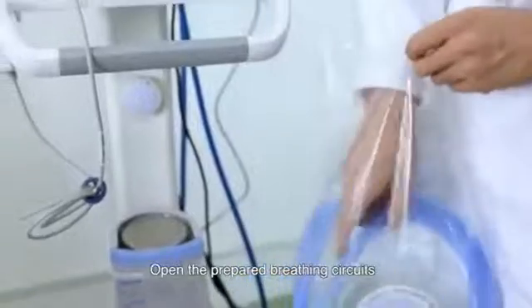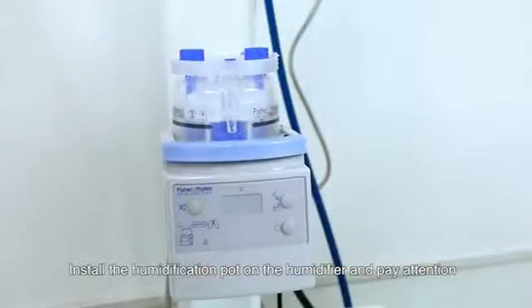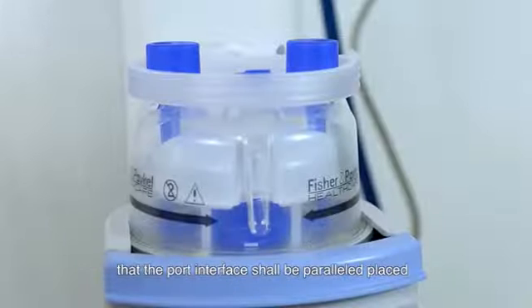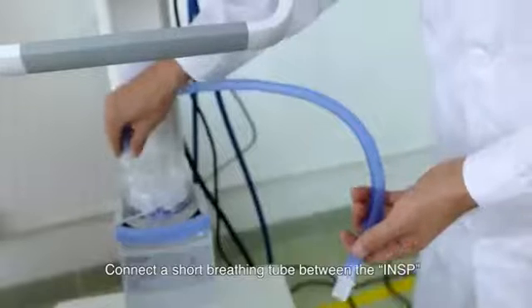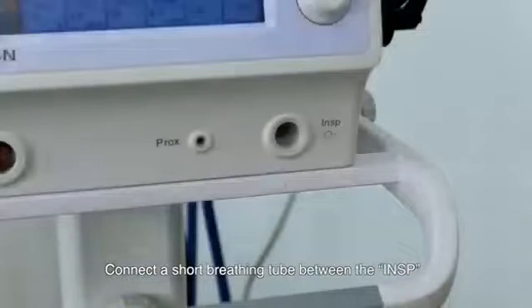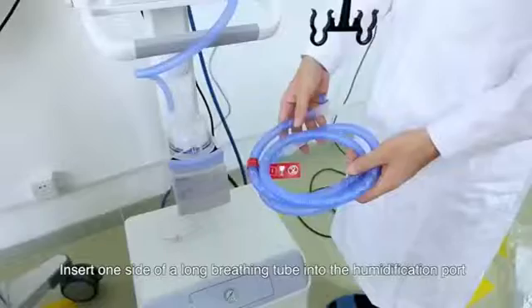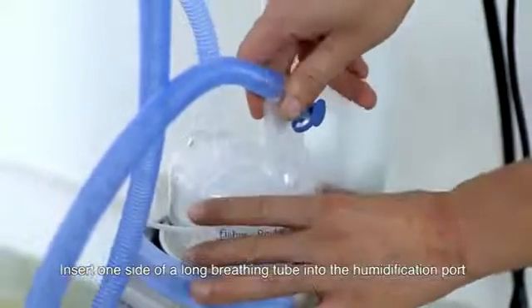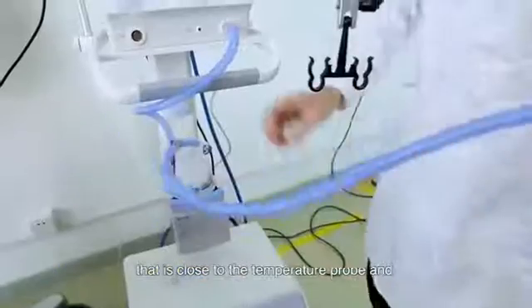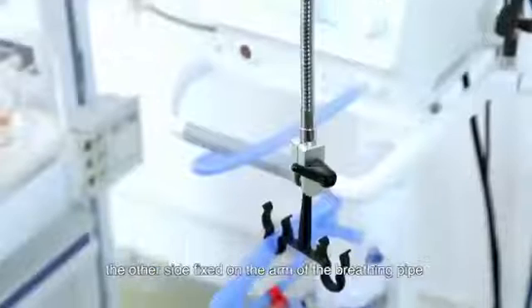Open the Prepare Breathing circuits. Install the humidification pot on the humidifier and pay attention that the port interface should be placed parallel. Connect a short breathing tube between the INSP and the humidification pot. Insert one side of a long breathing tube into the humidification port that is close to the temperature probe, and the other side is fixed on the arm of the breathing pipe.